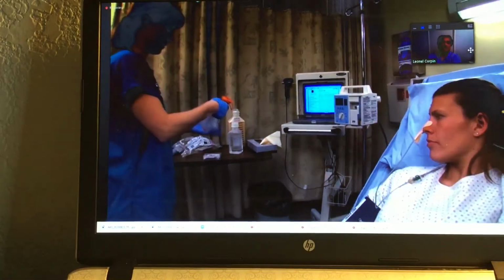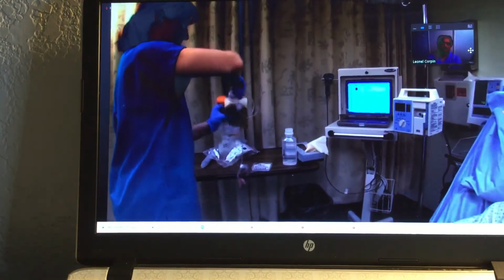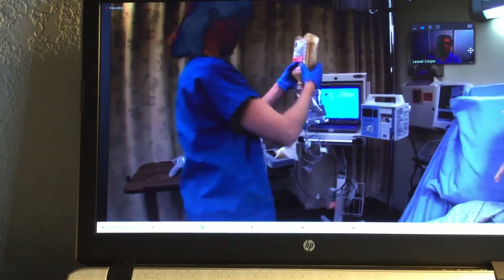This client has a feeding bag of sterile water hanging along with the formula to provide free water, per her provider's orders.